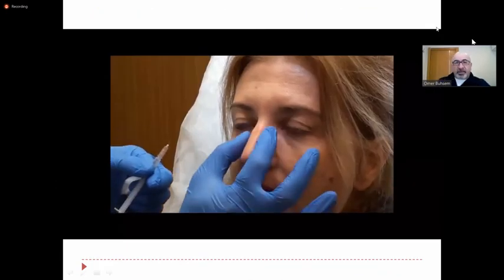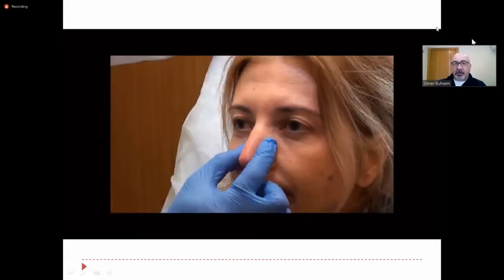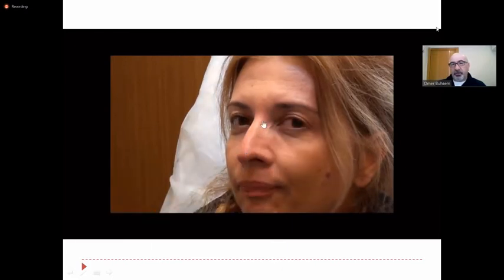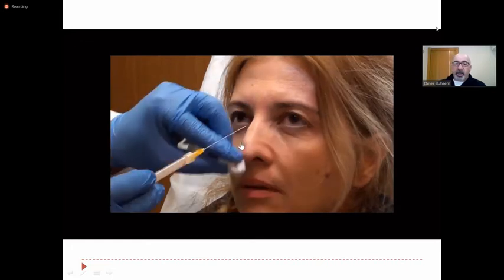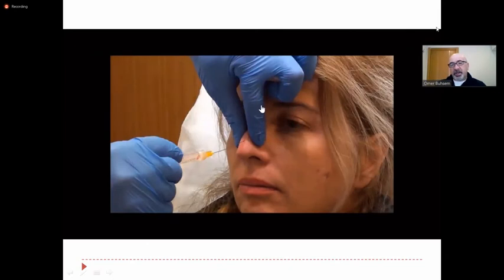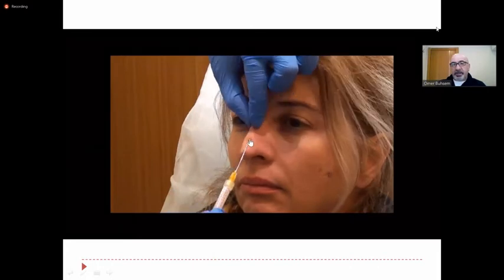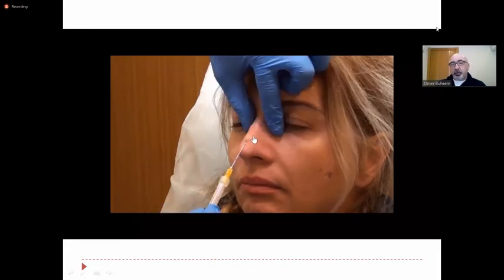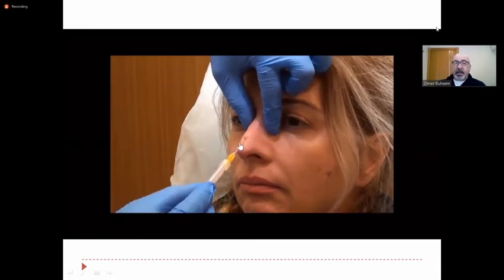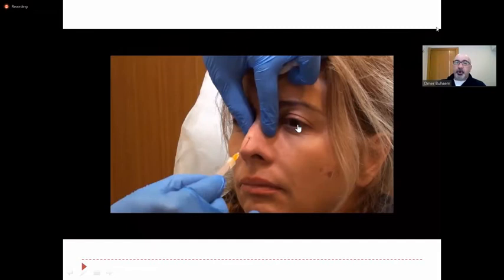Okay. This is a very difficult case. Why? Because of post-surgical deformity of the surface of the dorsum. We just introduce our cannula from here, and we will inject Algeness just to hide the deformities of the dorsum. We inject from here, we do some local anesthesia with lidocaine, and then try to be at the supraperiosteal and supraperichondrial plane very deeply. And you see, I am now doing some detachments, some subcisions before injection.